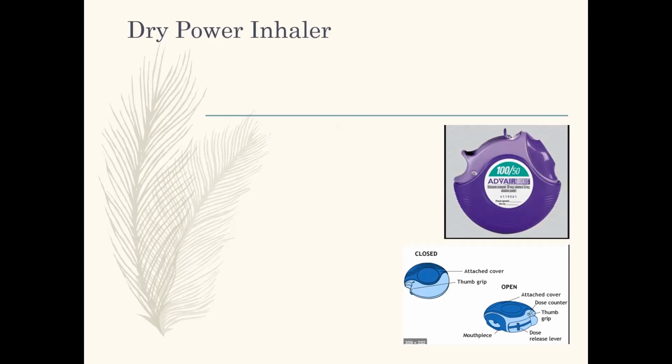There may be a place to load the dose where you push this back. This one has a little lever up here on the top. So this right here is your mouthpiece. Here's your little lever that you would push down this way and it loads your dose for you. We want to tell our clients to make sure that they breathe out slowly without their mouth around the inhaler. So they need to exhale without this being in their mouth.